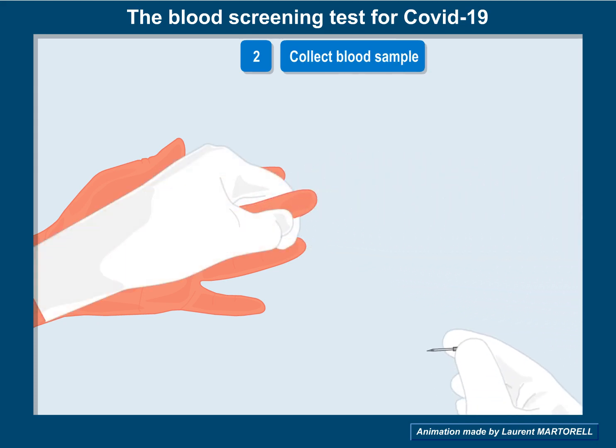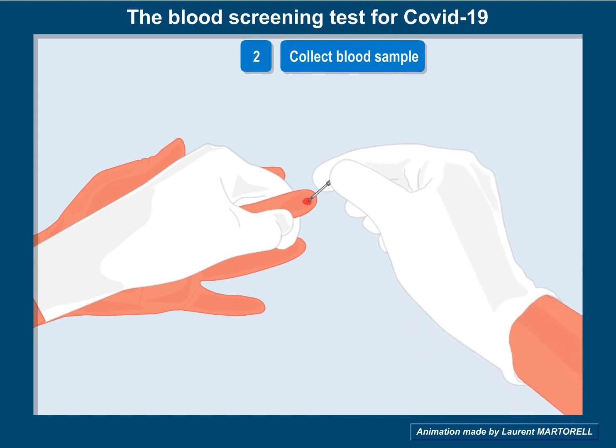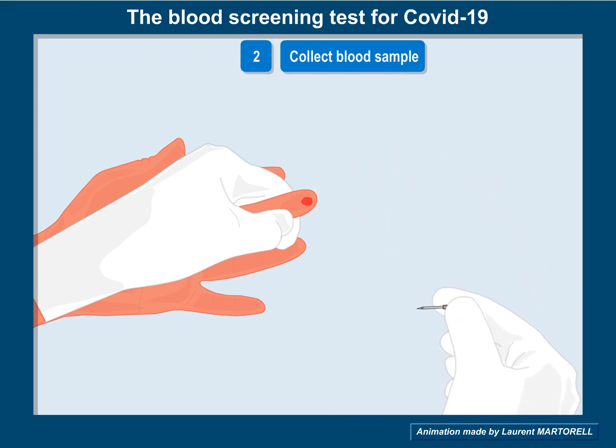Blood is collected by first firmly pricking the finger with a sterile lancet. Then, with a capillary, collect a blood sample.